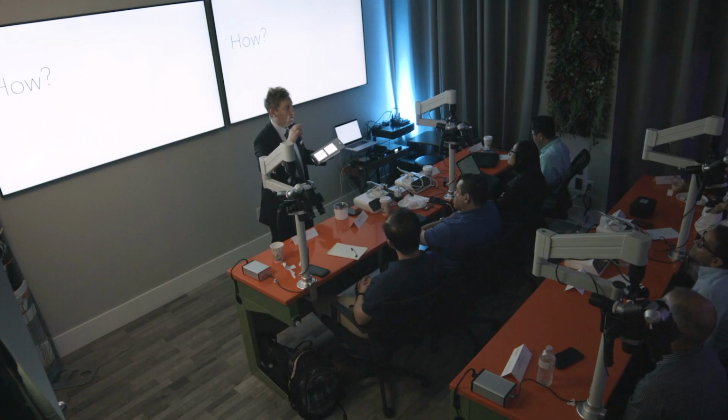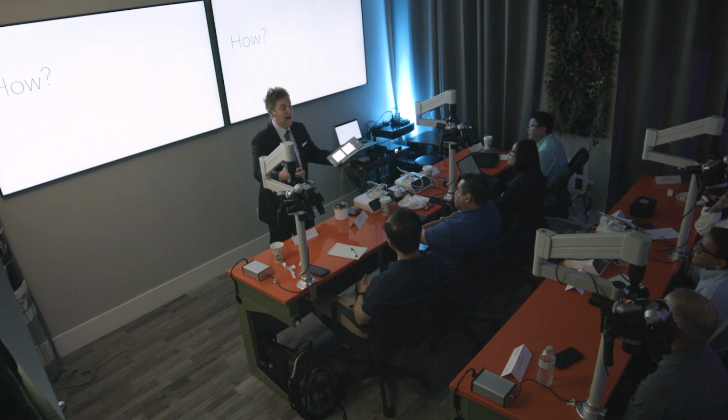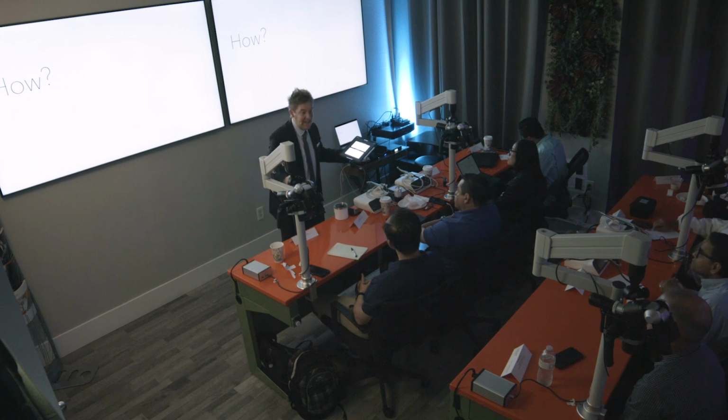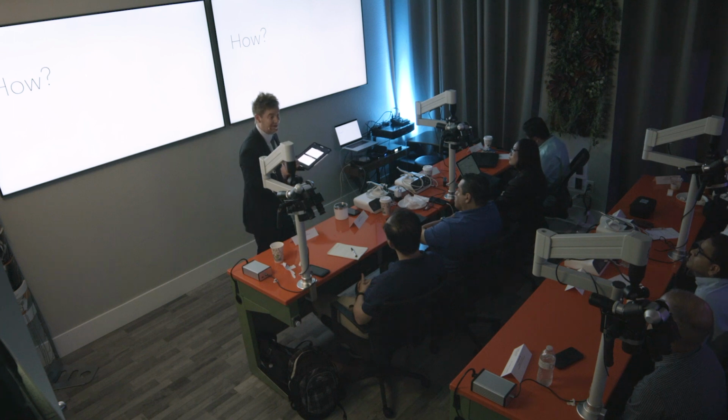They do not have the proper vertical restorative space needed, and they don't realize it until when? How about when you start to fabricate the prosthesis? The implants are already in, they're already integrated, and then you get to the point of starting to fabricate the restorative prosthetic and realize, I don't have enough room. Then what do you do?